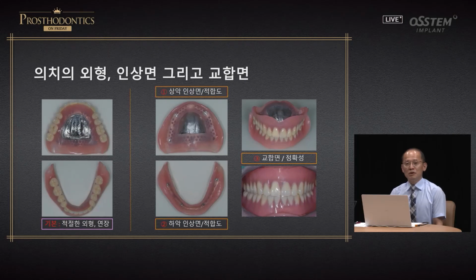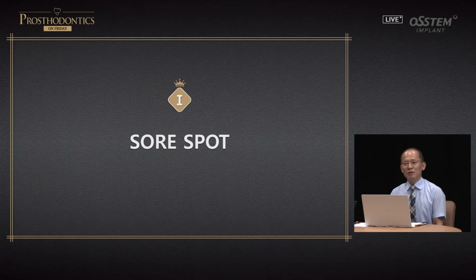First, for the denture itself, I think it's less about how to create dentures and more about how to adapt them and make the dentures comfortable for the patient. The appearance and impression taking are important, but impression taking and occlusal adjustment are sometimes difficult areas.